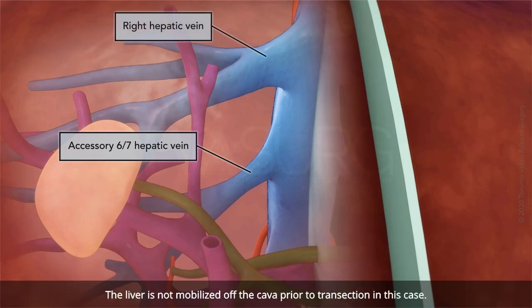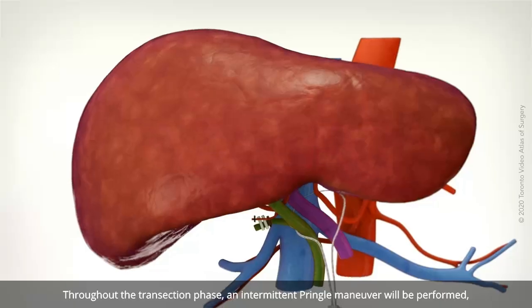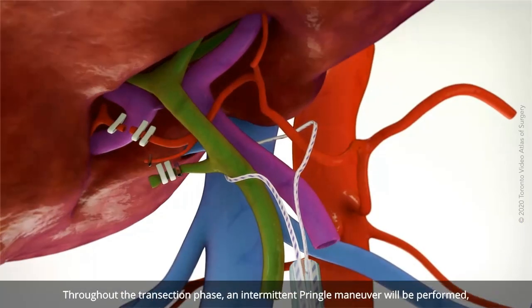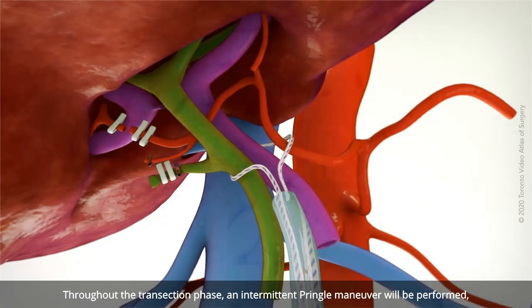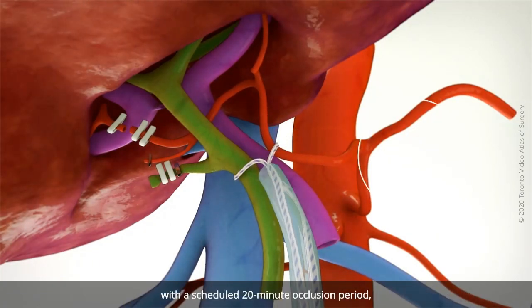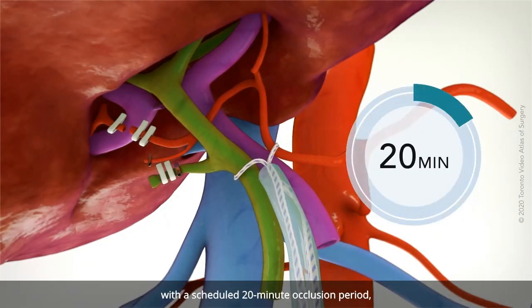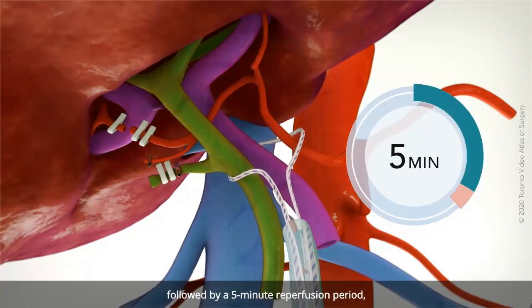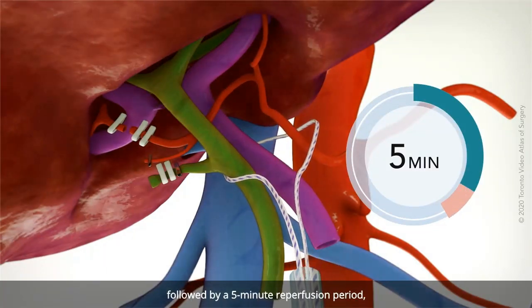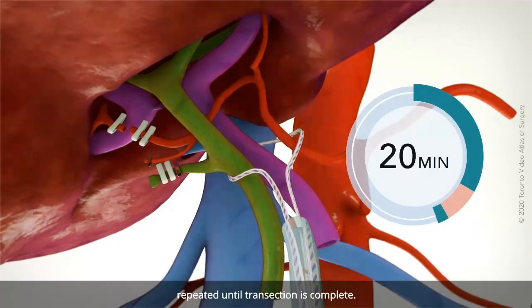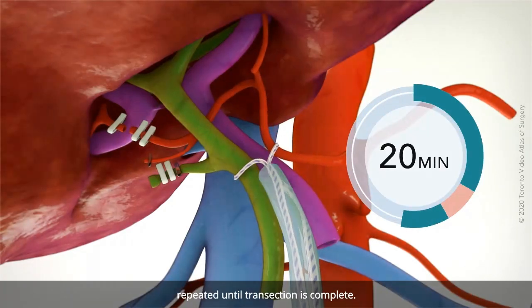The liver is not mobilized off the cava prior to transection in this case. Throughout the transection phase, an intermittent Pringle maneuver is performed, with a scheduled 20-minute occlusion period followed by a 5-minute reperfusion period, repeated until transection is complete.